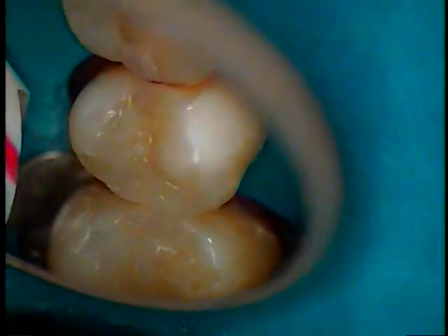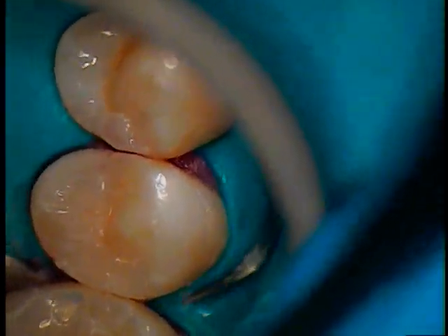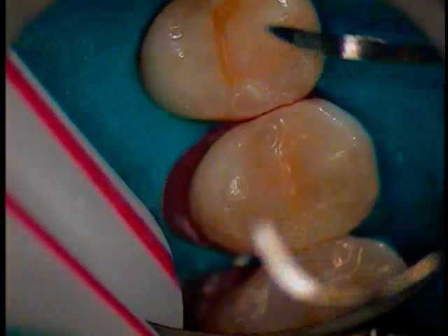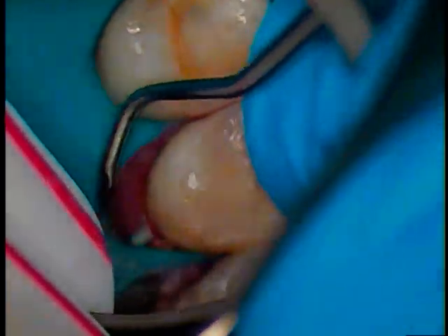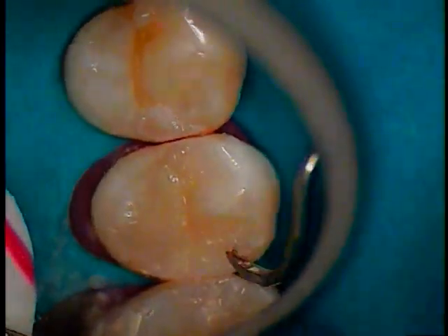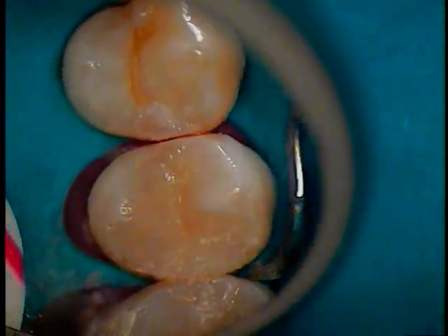Now I get my scaler, and I'm going to come up and down and just get rid of some of this excess stuff. Most of the time, it's that flowable that leaches out a little bit. And that means it's sealed. Okay. So I'm going to finish this up.